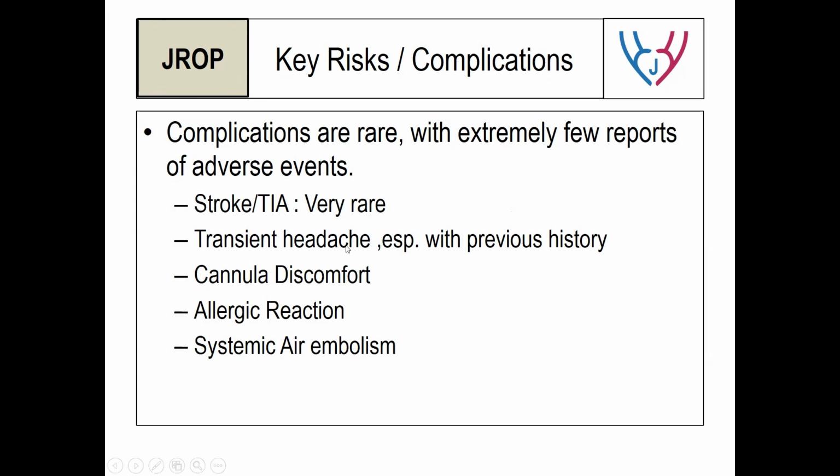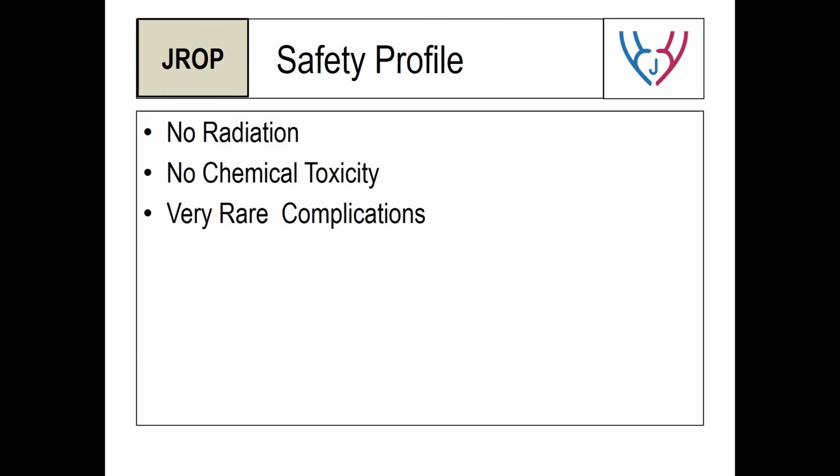Then we can have a transient headache, pain at the site of the cannula. Allergic reactions are very minimal because we hardly use anything in it. And systemic embolization if you are really pushing too much air when you're mixing the contrast. Very good safety profile.